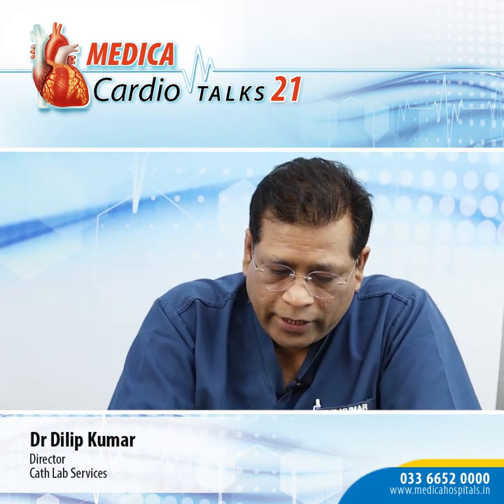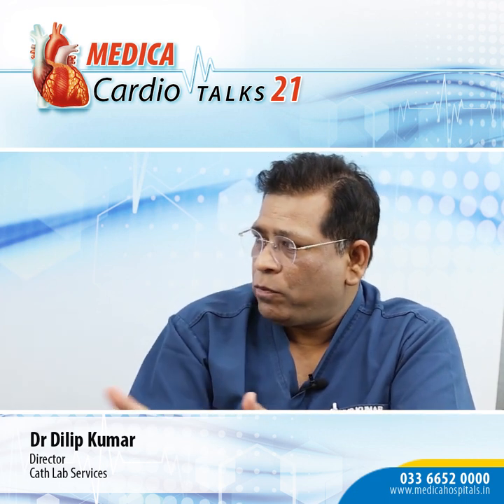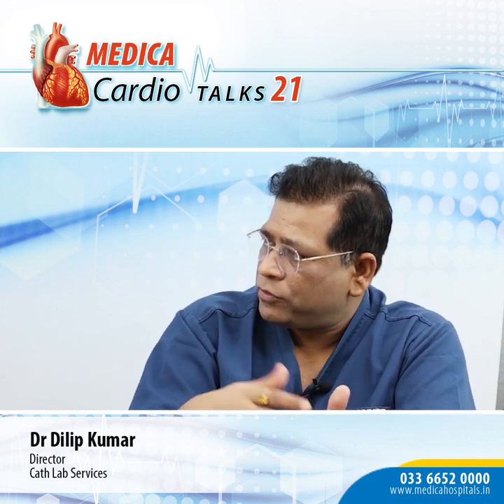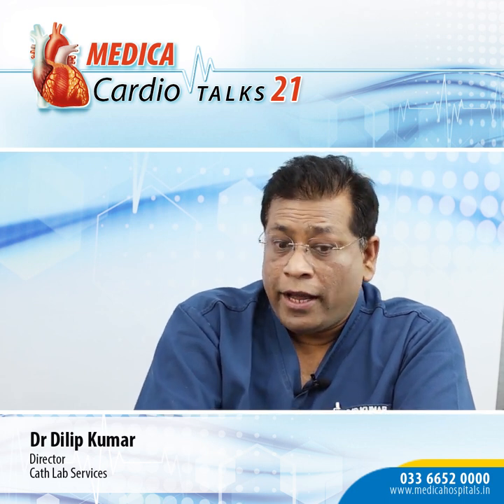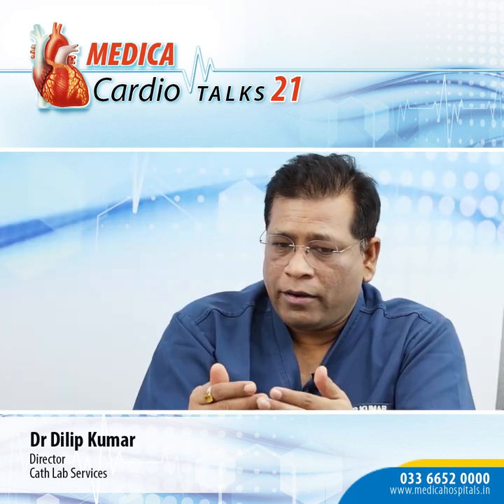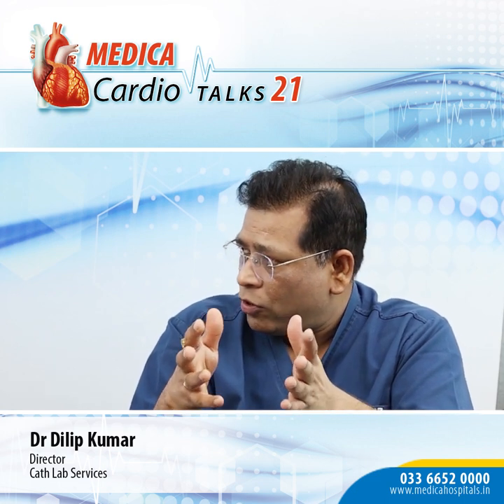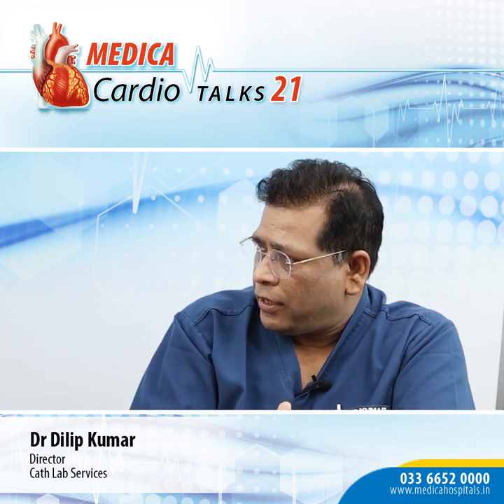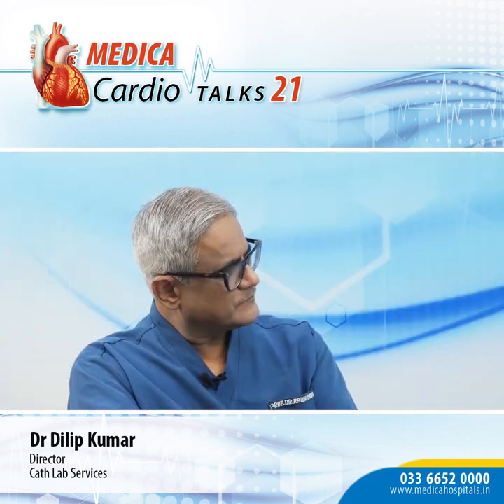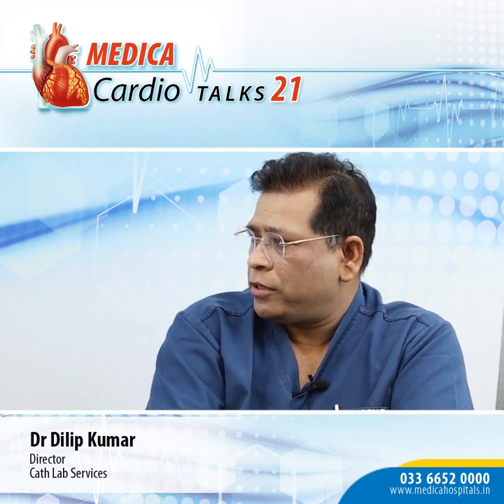For transcatheter tricuspid valve repair, number one, the patient should have high surgical risk. You rightly pointed out LV dysfunction, RV dysfunction, pulmonary hypertension, very sick patients, COPD patients, very high EuroSCORE. And provided the tricuspid valve morphology is suitable for TriClip, it should not have too much tethering. The coaptation gap should not be more than 11 millimeters, where the results are not good. And a very hugely dilated annulus. These three factors preclude the use of TriClip devices. In such situations, when the surgical risk is very high and TriClip is not suitable, then heterotopic repair should be considered.